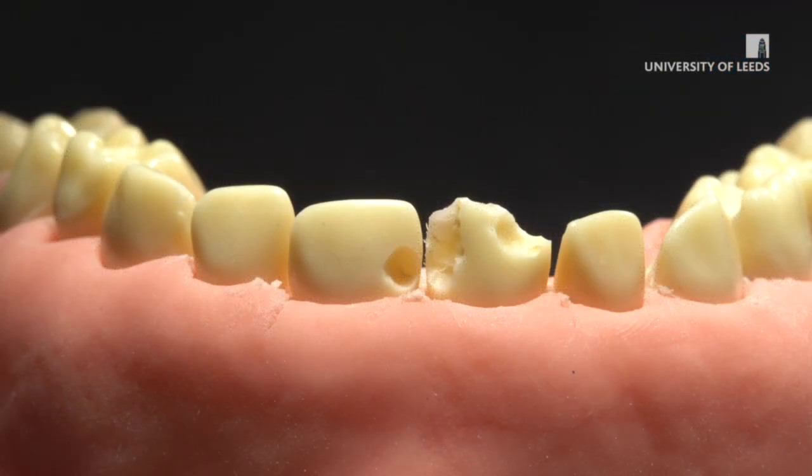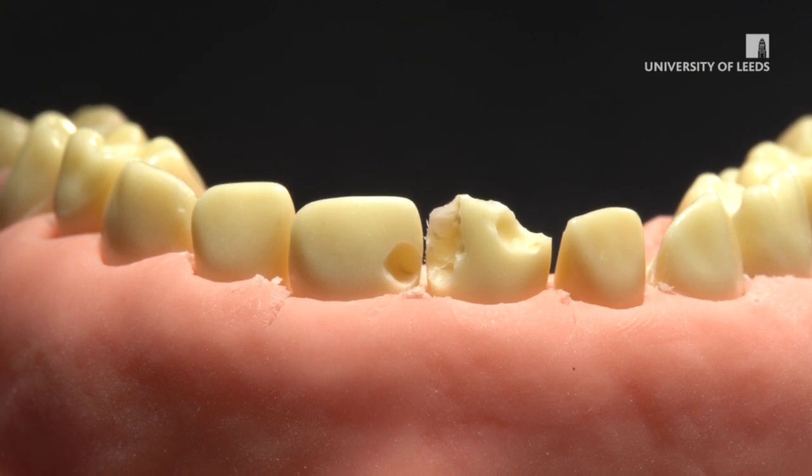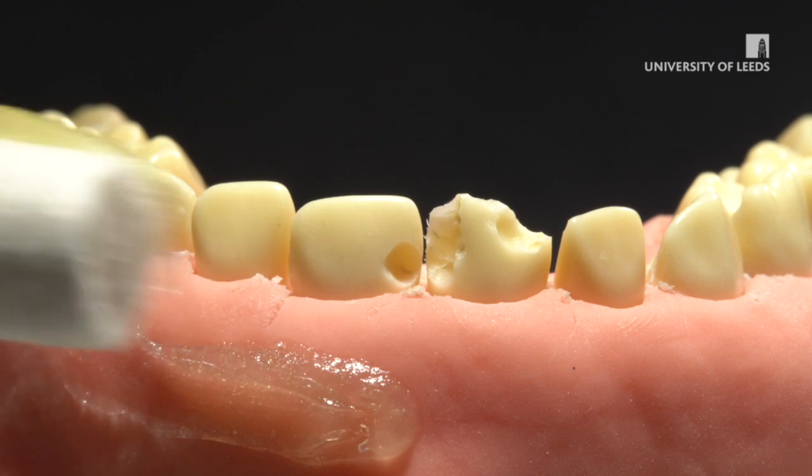I'll now show you how to use silver diamine fluoride on a model. You don't need to remove any dental caries before its application. However, if there is obvious food debris, it's better to remove it either with prophylactic paste or with an excavator. Wash the teeth and make sure they are clean and dry.